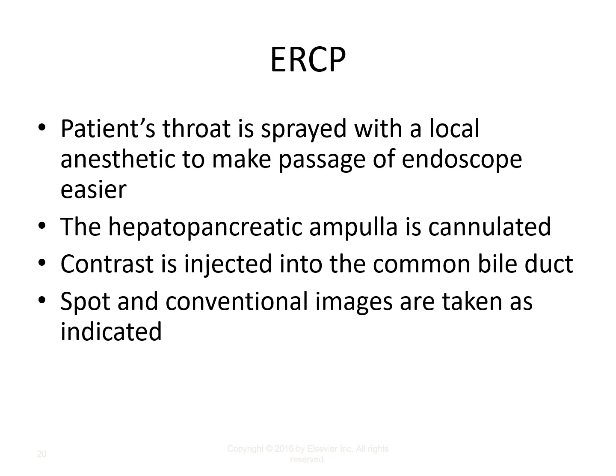Once you inject contrast, you'll be called upon to take some AP projections. You might do some RPO projections, and it might turn into a therapeutic. If there are stones, then the gastroenterologist may choose to use the endoscope and various tools employed with the endoscope in order to extract the stones and get the stones out of the common bile duct.